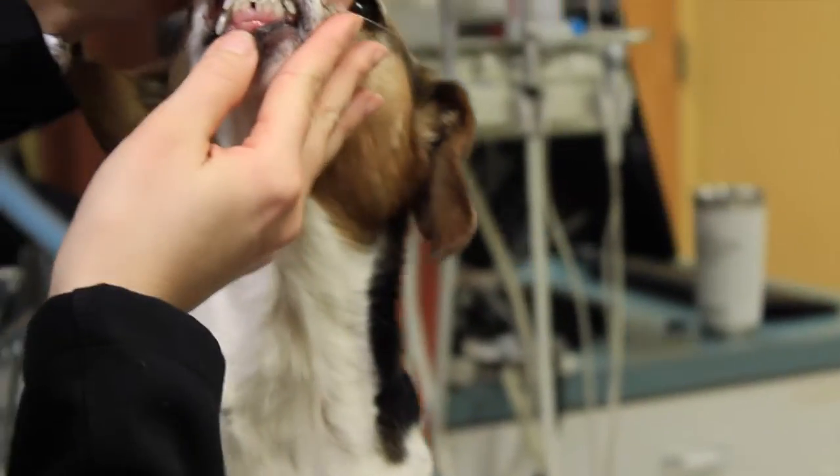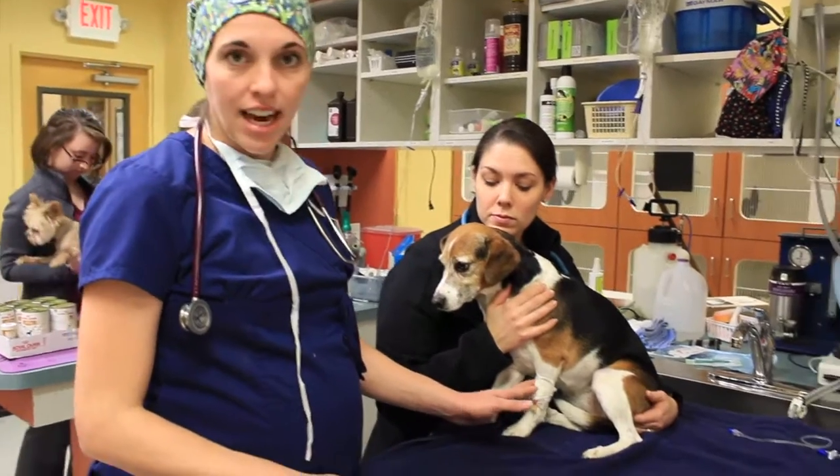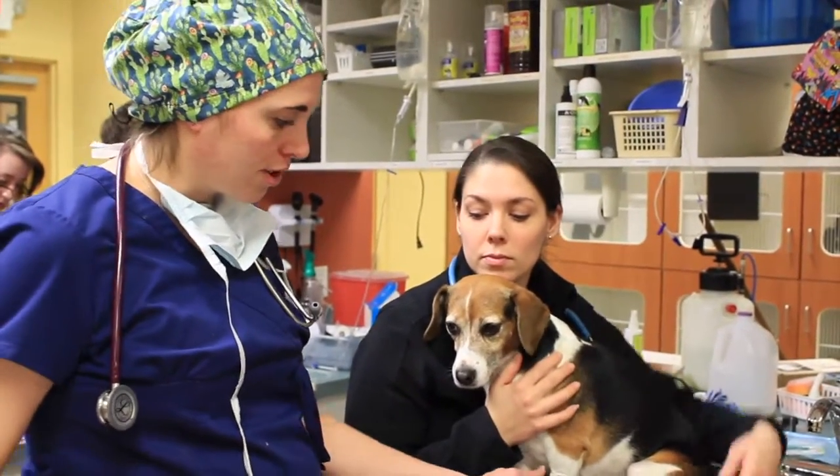The first thing that we do preparing them for surgery is give them a pre-medication. We've placed an IV catheter, so we're going to give her a little bit of sedation and her pain medications preemptively so that those are on board by the time she's in surgery.